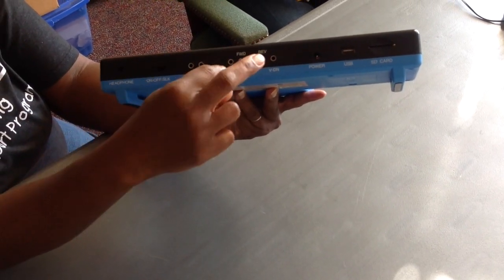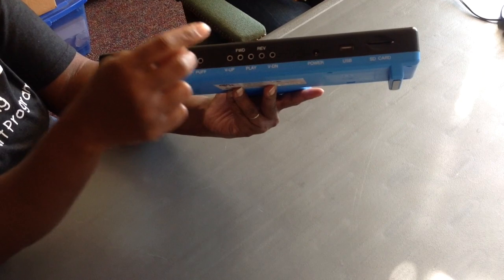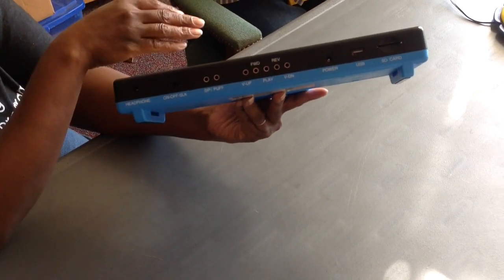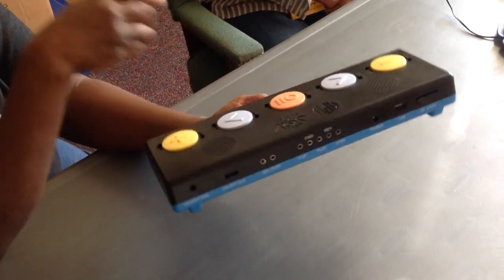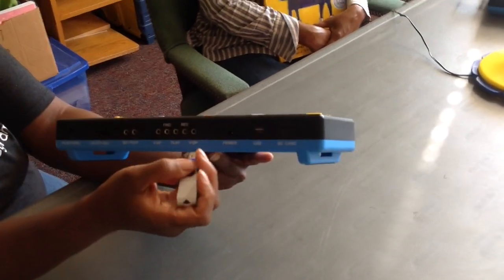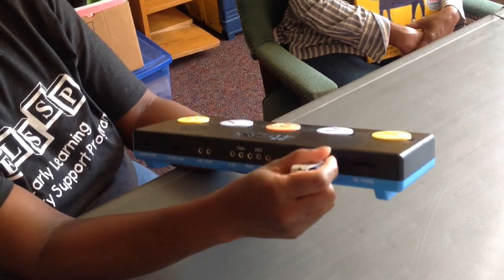You can put 2 switches, say in the play and the fast forward. Just have to make sure you know which one is which, and then each switch to control each function on the Joy Player for the kids who can't push the button. And then this is where you put your USB drive in.